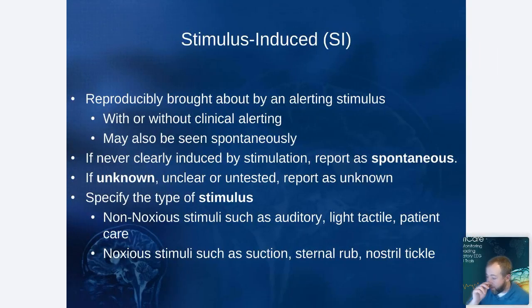So I'm going kind of fast through this part because we have a lot to cover and we're running out of time. Stimulus induced is another modifier that you need to make sure you mention, for reproducibility, brought about by an alerting stimulus. It can be either with or without clinical alerting.